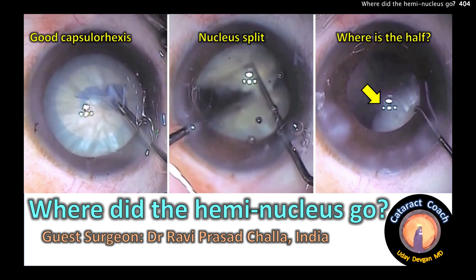CataractCoach.com. Where did the hemi nucleus go? With special guest surgeon Dr. Ravi Prasad Chala from India.